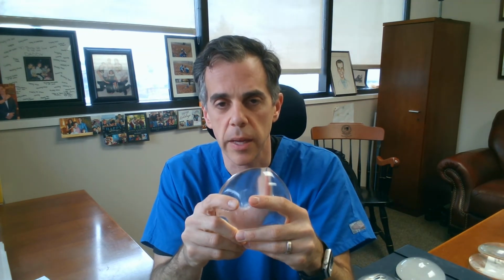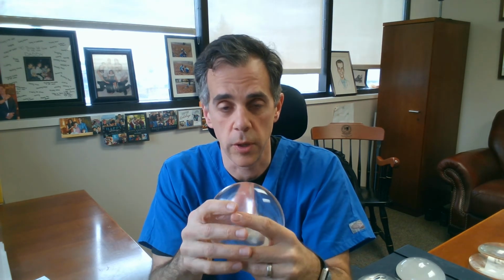So this is the workhorse. This is the one we use for the majority of my patients because of feel, because of shape, because of look. It looks more natural. So, like we talked about in terms of projections, that's what we're going to find in the consultation. You're going to come in, we're going to do an exam, we're going to do some measurements based on some other factors, not just the width, but the thickness of the skin, the stretch of the skin, how much breast tissue cover you have. But that's the primary way that we look at the difference between different types of implants.